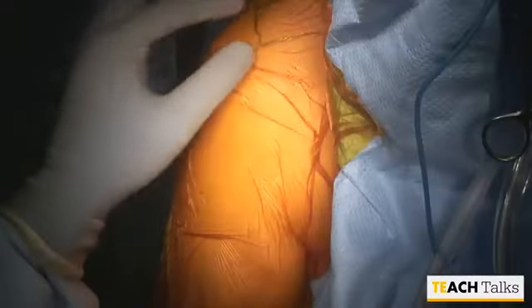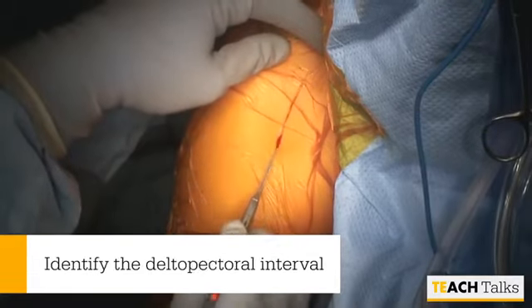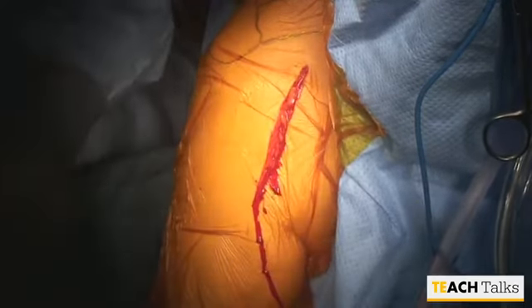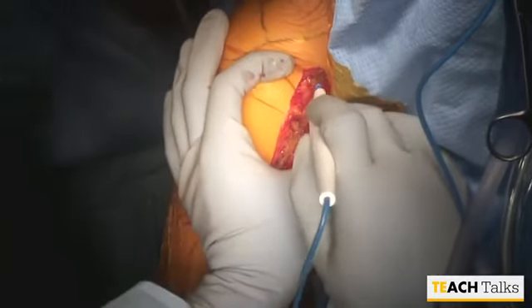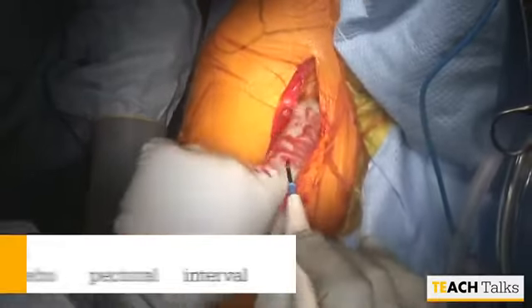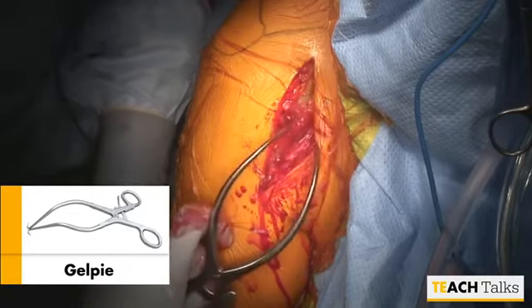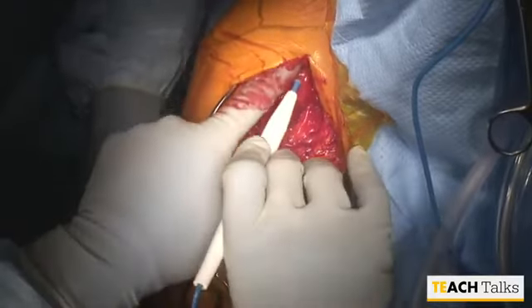Once the patient is prepped and draped, the next step is the delta pectoral exposure. We begin the procedure by first identifying the delta pectoral interval. Frequently that can be done by locating the coracoid. Palpation of the soft tissues usually allows identification of the sulcus between the deltoid and the pectoralis. We start off with a skin incision using a fresh blade and move on to electrocautery. We then proceed with some blunt dissection of the subcutaneous tissues down to the delta pectoral interval. I prefer to use a Gelpi retractor as my retraction device of the skin and subcutaneous tissue, though there are a number of commercially available instruments which are surgeon preference.